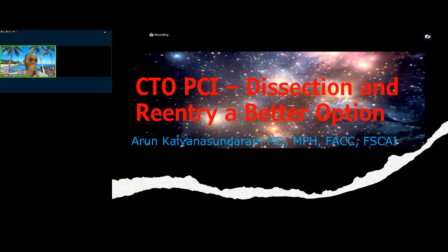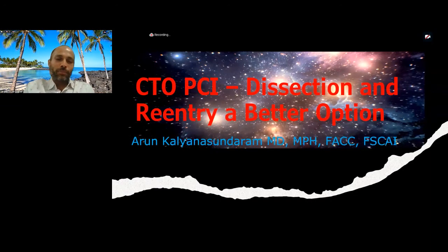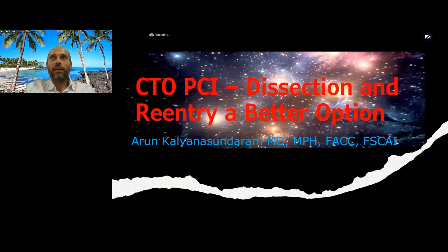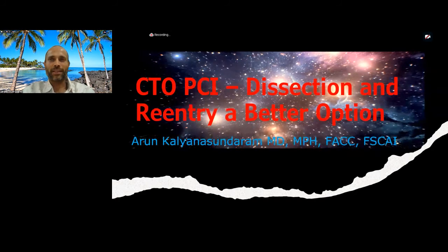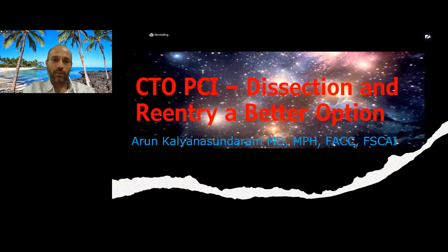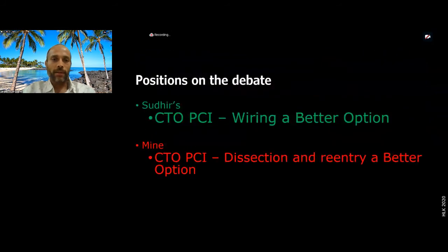By the way, disclaimer, I got to tell you, Dr. Sudhir Rathore is a really good buddy of mine. So for the most part, yes, we are supposed to debate, but we have to find reasons to debate because pretty much there's consensus on a lot of the stuff that's being said. So I'm going to start with that disclaimer. Really, just to clarify the position, he's supposed to talk on whether wiring is a better option, and I'm supposed to talk on whether dissection and reentry is a better option.